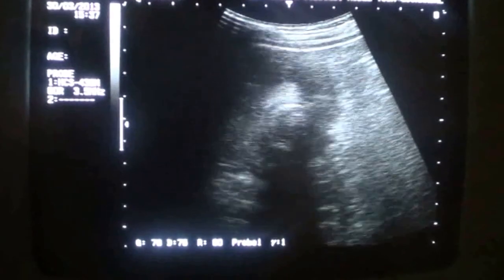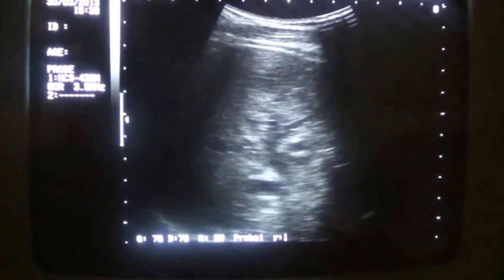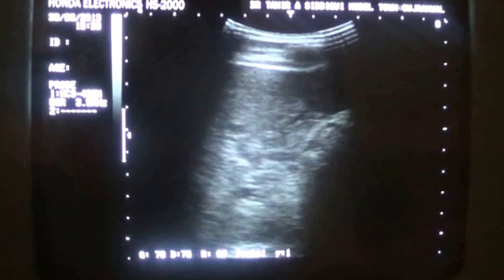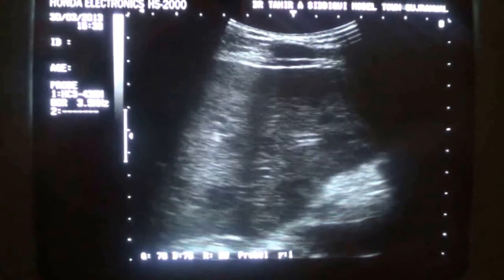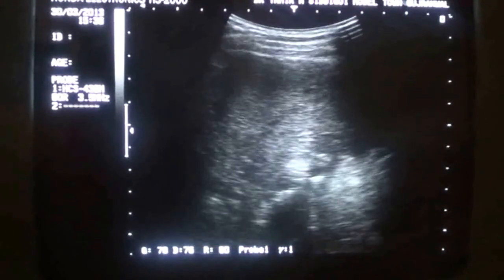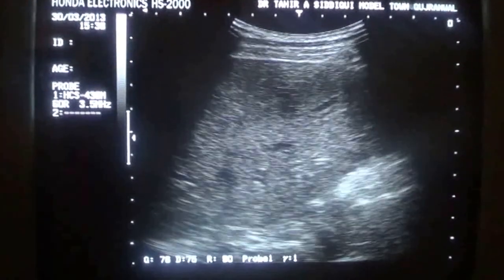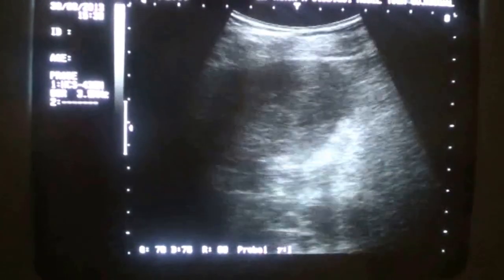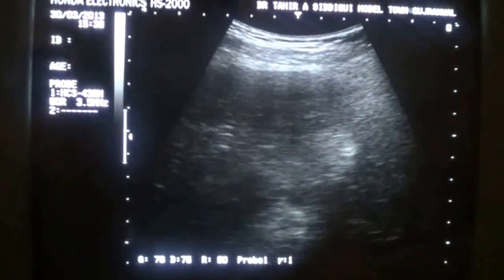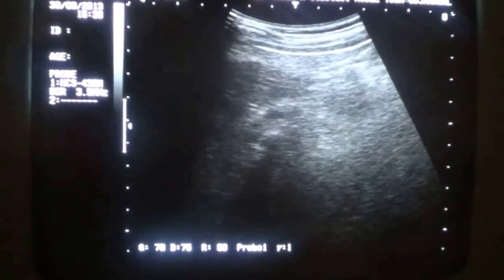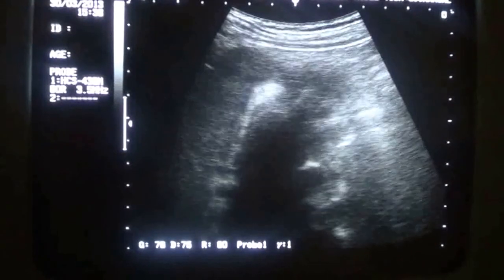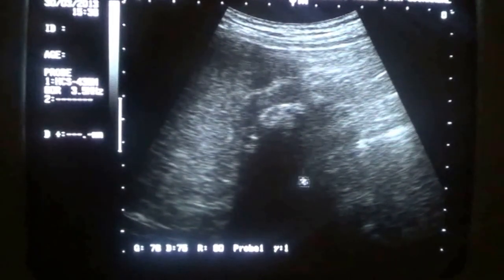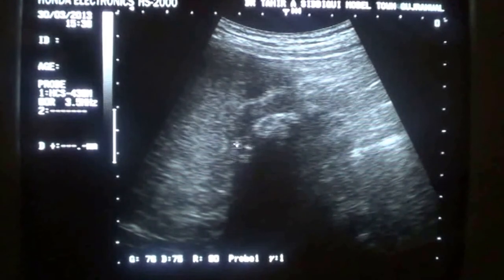The gallbladder shows ill-defined margins. With all these findings, you can see intrahepatic bile duct dilation. You can also see a hypoechoic, rounded, ill-defined lesion. This is a case of gallbladder pathology of an aggressive nature. The reason being that we cannot define its anterior wall, which is only being identified by the calculus it contains.